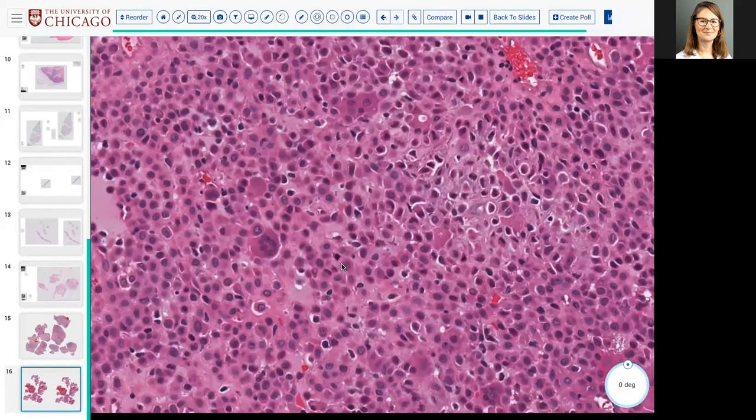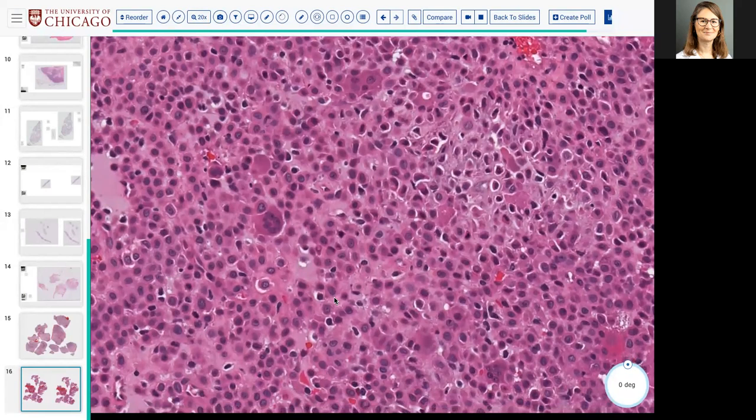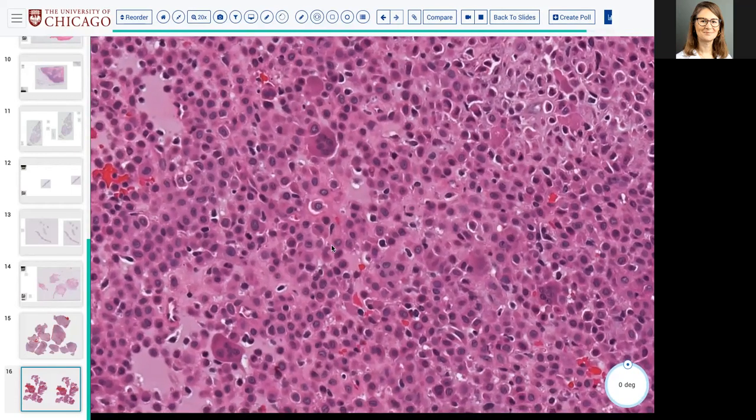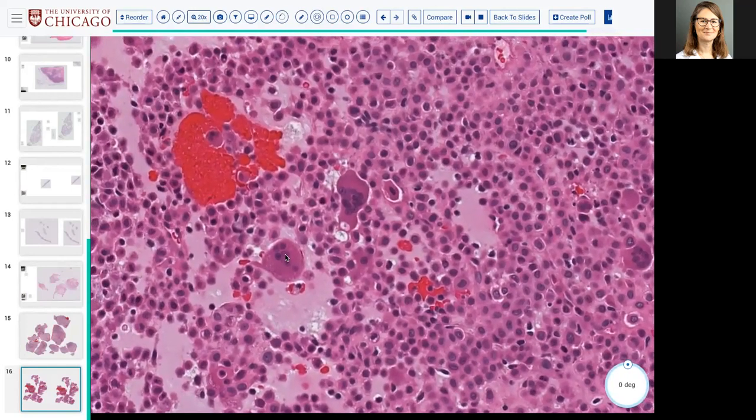The cells behind the giant cells, the mononuclear cells of chondroblastoma, you may remember, tend to be almost kidney bean shaped or curved. It's a little bit blurry, but here's a nice one that's kind of curved, rather than plump with nucleoli.